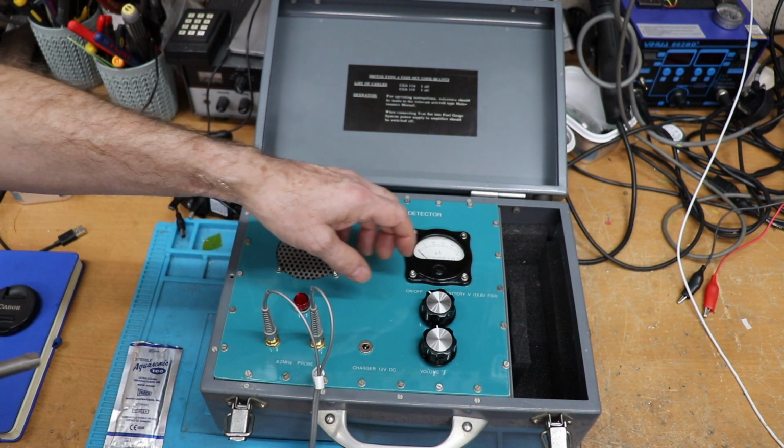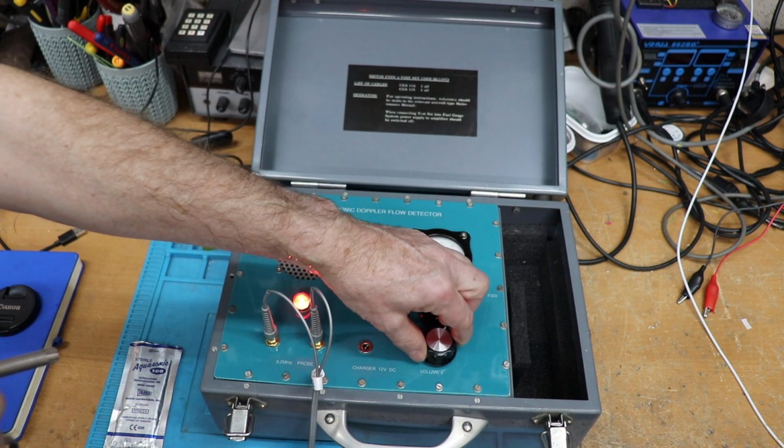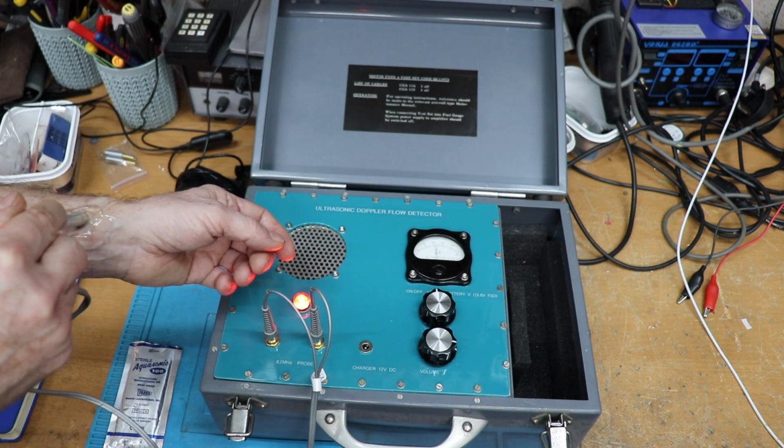So just to show you how we use one of these, just for general detection of blood flow, I'll turn the volume up. I've put some ultrasound jelly there.